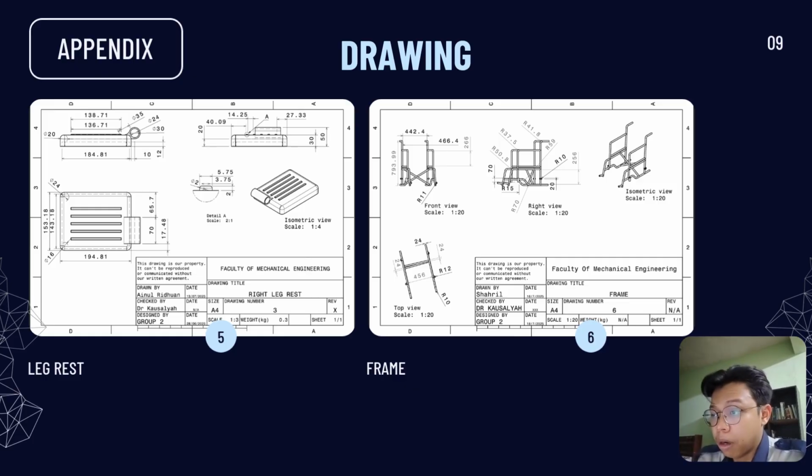So next up is the main part of the wheelchair, which is the leg rest and also the frame. We do most of our finite element analysis on this part, since most of the force will be distributed in the frame and also on the leg rest. In making the frame, we had to do a lot of research on how to make it and how stable it is, and also on the symmetrical part of the frame. Then we have the leg rest, which is simple enough, where we just use fillet for most of the part, for the smooth part of the leg rest.